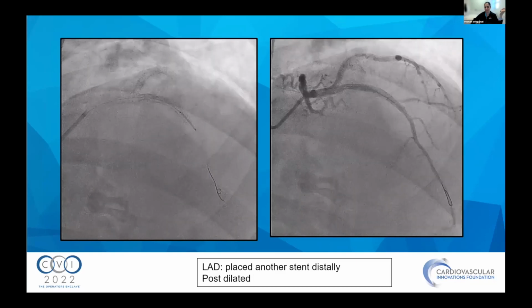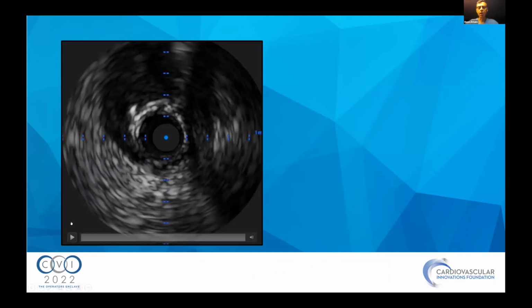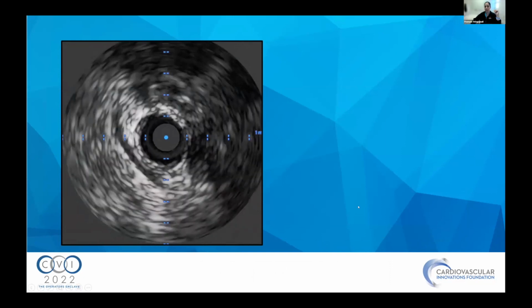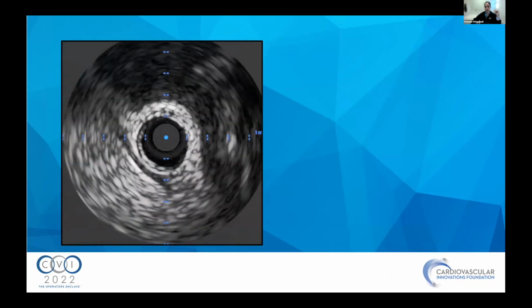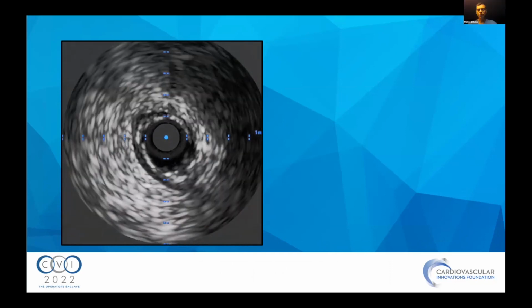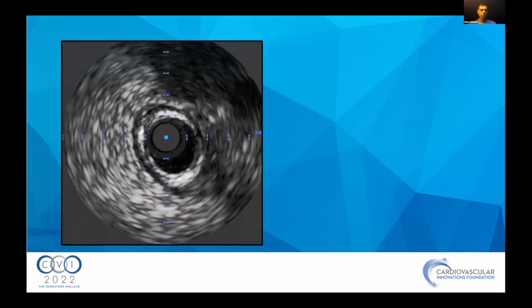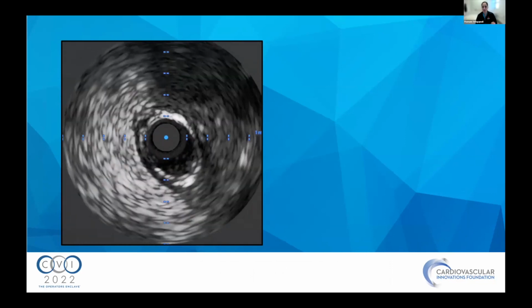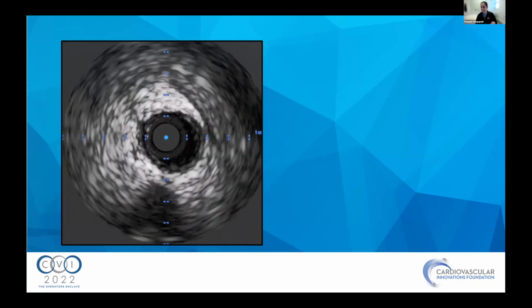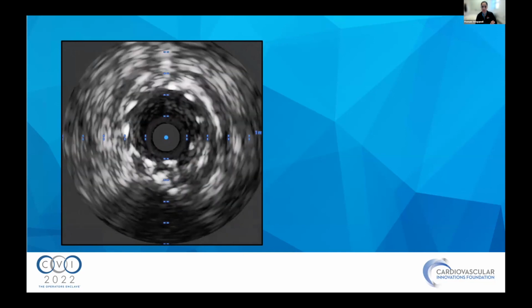So did not do brachytherapy, Manos. And this expanded with just ballooning, the LAD, the under-expanded areas were just expanded with the regular balloon. Expanded very nicely with the NC balloons, and I believe I used a cutting balloon as well in the diag. So again, it was just an issue of, I guess, stenting without imaging guidance in the beginning, right? To make sure it's well expanded, do you think? I think it was, the stents were placed when he was in shock, and the stents were probably undersized or underexpanded because it wasn't done in a perfect way. So I think that was the mechanical issue at the time.